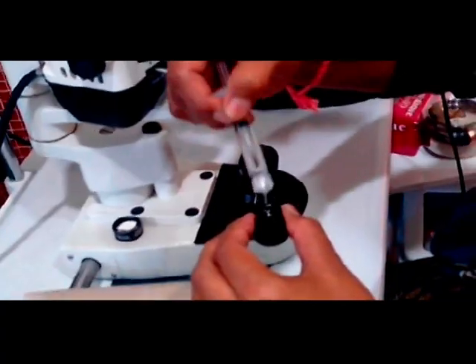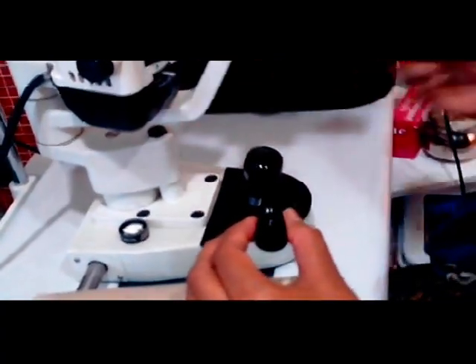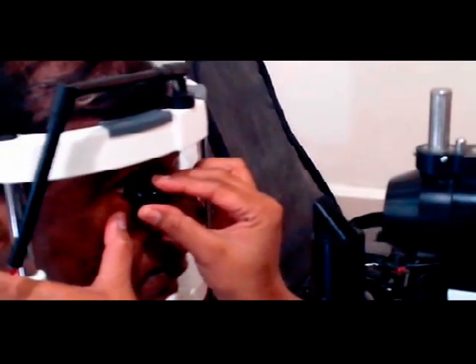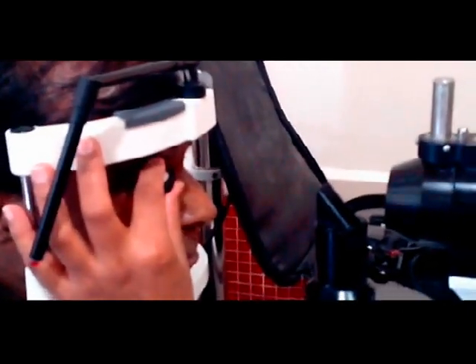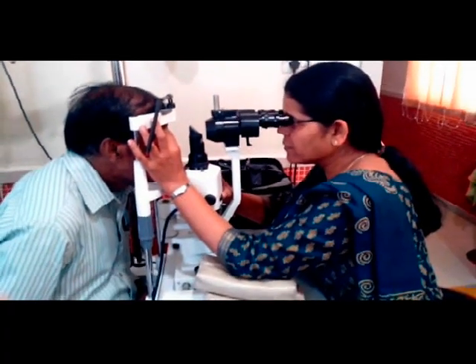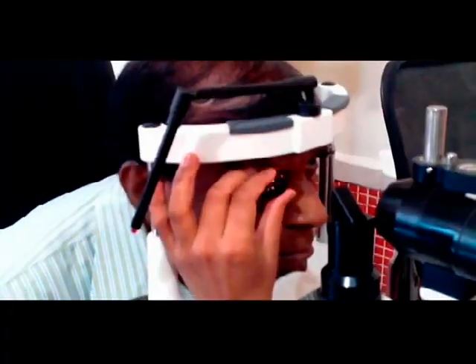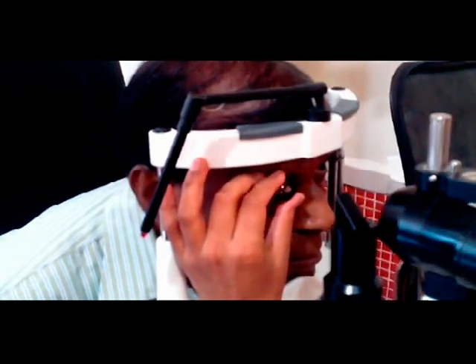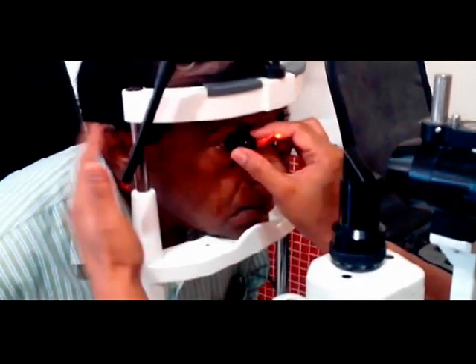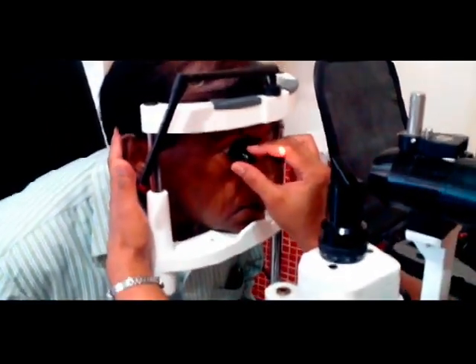Gonioscopy is performed under topical anesthesia. When using a scleral type of lens, a coupling agent — methylcellulose — is used. The patient is asked to look up and the lens is gently guided into place. This is done under dim illumination, and the patient's head and the examiner's elbow should be properly rested. All quadrants are viewed, and when taking out the lens, it should be gently removed.